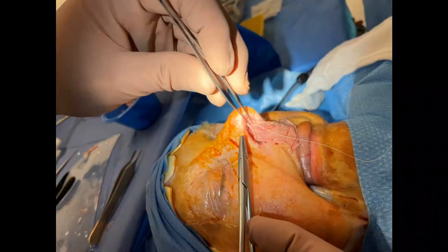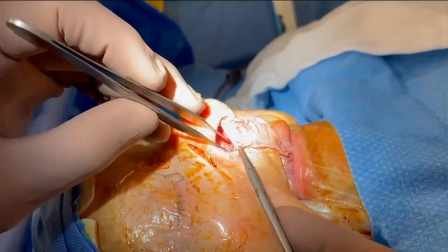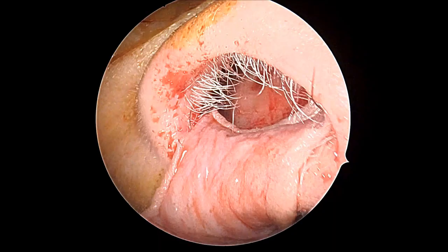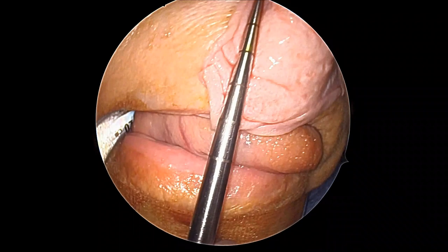The graft itself is sutured to the squamous mucosal junction, which was diathermy defined, with 5-0 vicryl rapide sutures. It's inverted at this point. The length is decided using the Cottle's Dissector as a guide, and here we can see the length is appropriate.